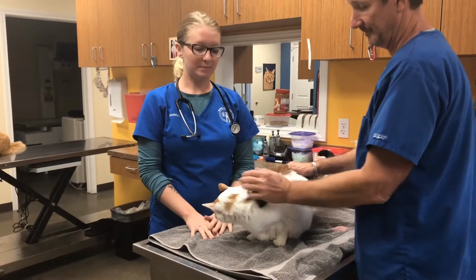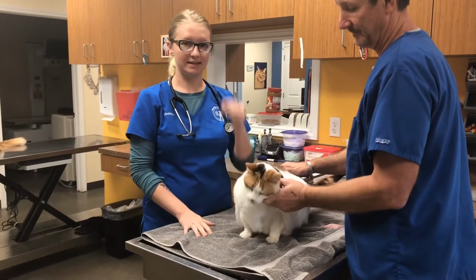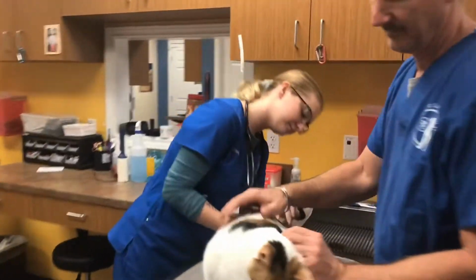Okay, now we will be demonstrating a physical exam on a cat. So the first thing I will do is obtain TPR, or temp, pulse, and respiratory rate. I have a loop thermometer here, so I'm going to start with the temperature.